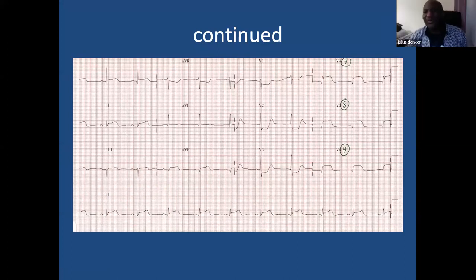Spot on. So you don't need to do that. But some registrars might end up wanting to do that. So I mentioned it just in case somebody wants to. It will be opposite because your V1 to V3 is looking at the front, the anterior part, so it's always going to be upside down.